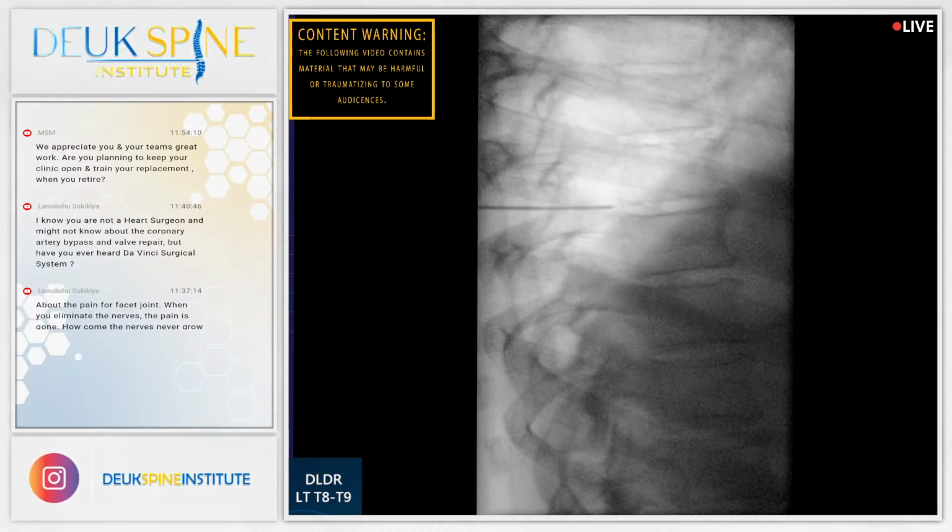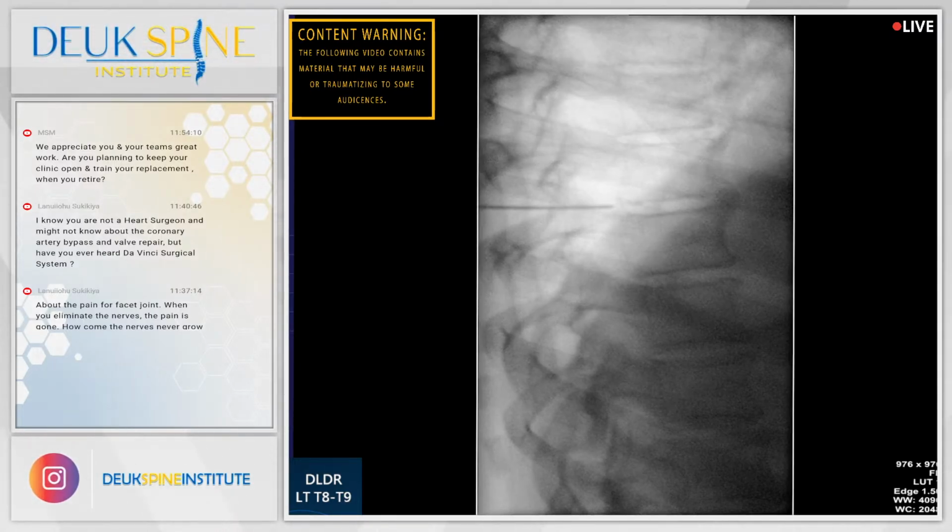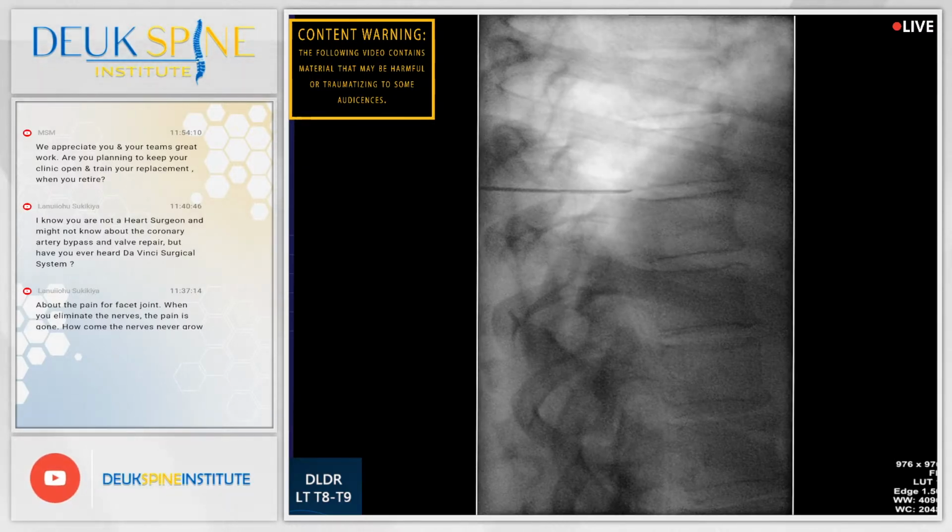Well, yeah, that's fine. Let me just triple check everything. Shot? Yeah, it feels like disc to me. Feels soft. I think we're there. It feels like scar tissue disc. Yeah, we're there. That's amazing.